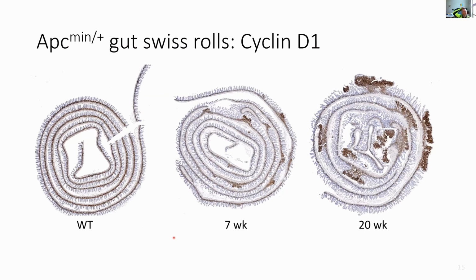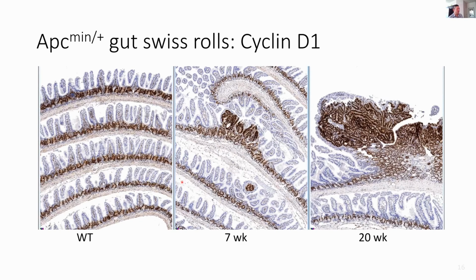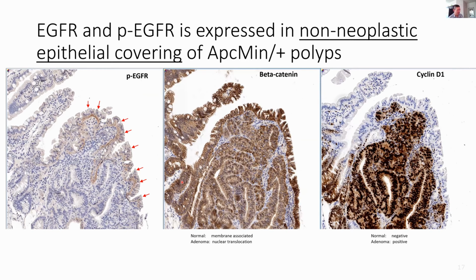Anyways, those are very pretty. Yeah, we had a really good, so this is cyclin D1, and we had an amazing Swiss roller, not here anymore. Basically, nothing earth-shattering science-wise, but bread and butter characterization of signaling component expression in progression between 7 and 20 weeks, and for the different markers. So we're still just working on the basic pattern of expression.